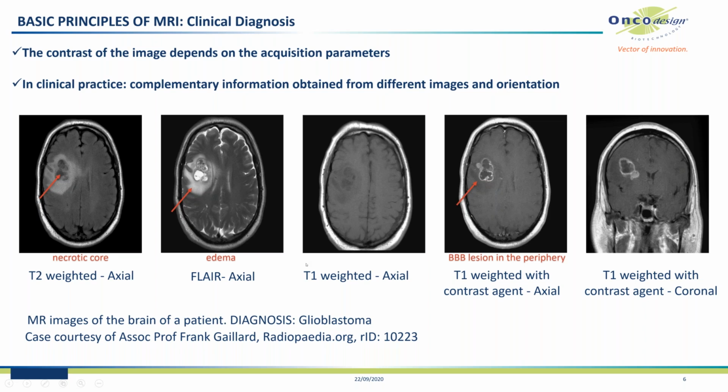So in clinical practice, they usually do a series of different images with different contrasts to combine the information coming from these images to obtain a complete diagnosis.